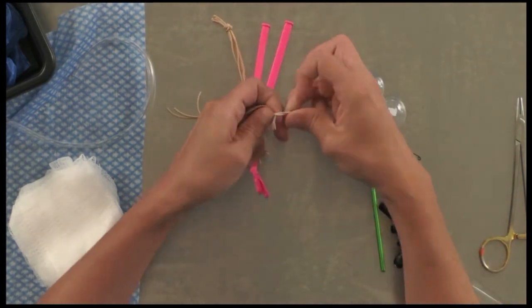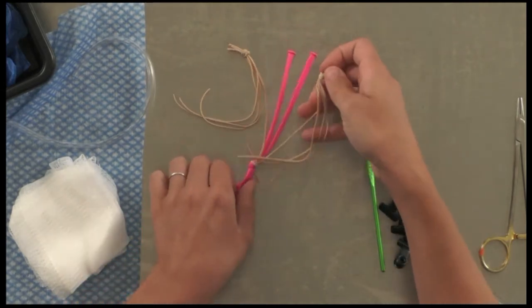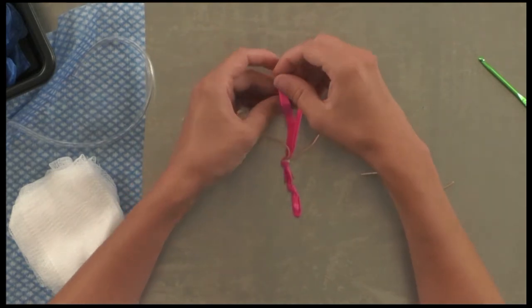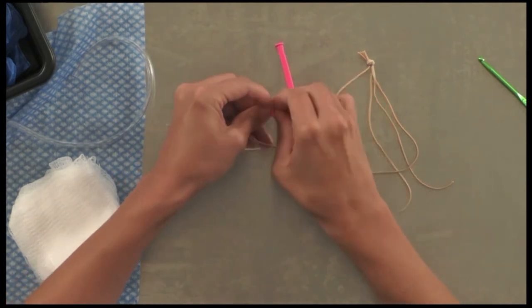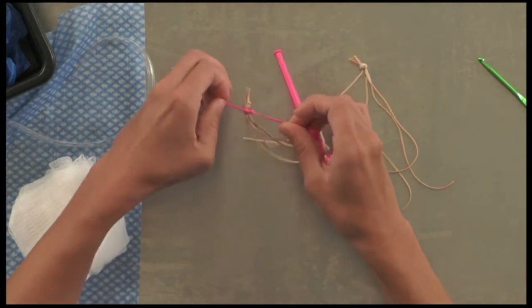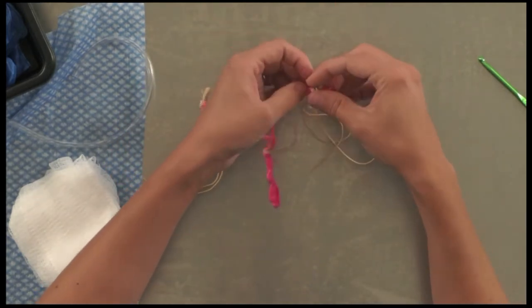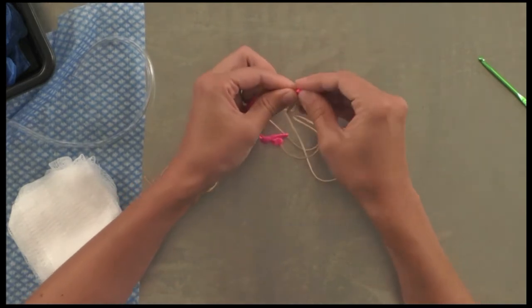That knot is going to represent your ovary. You need to affix that ovary to the uterine horn, so just tie your uterine horn around that knot — that will be the connection point. You should have three strands dangling and one connected to the uterus itself, so four things coming off your ovary.